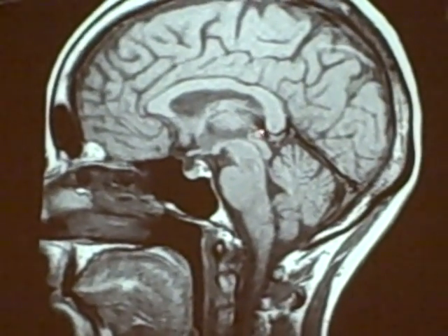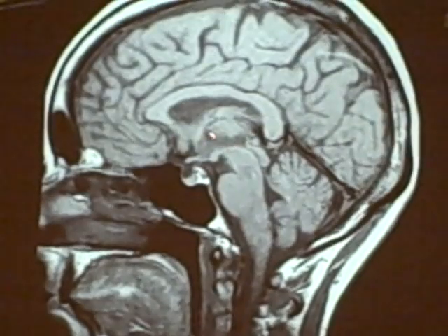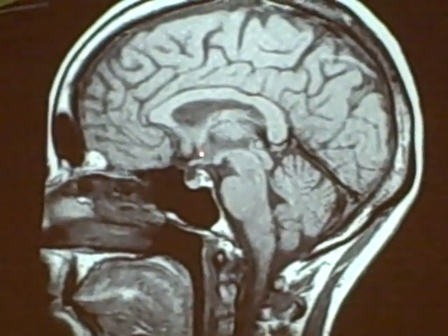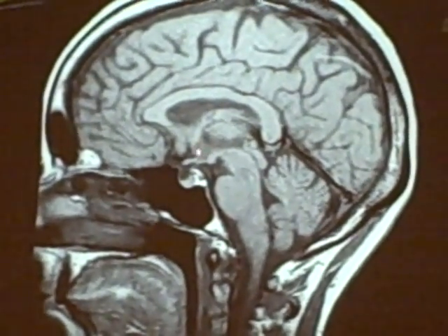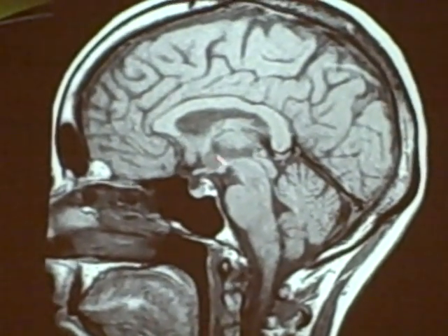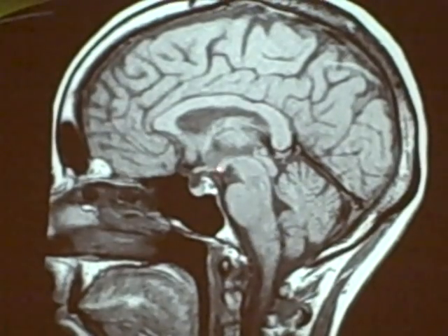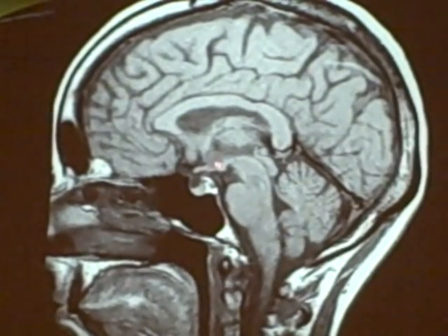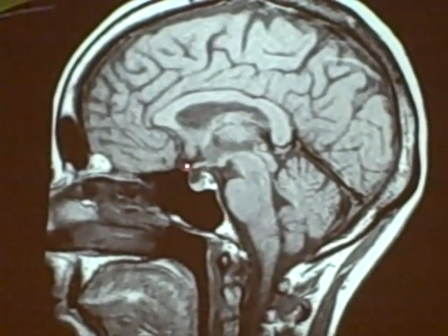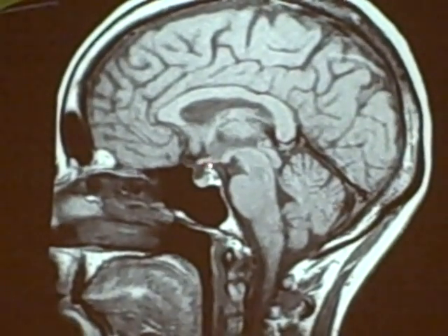The pineal gland would be right in here, but it doesn't show up that well. This is the thalamus, and this area right in here is the hypothalamus. We've pointed out several times all the things around the hypothalamus — mammillary bodies, which really are a part of the hypothalamus, and the optic chiasm right here.